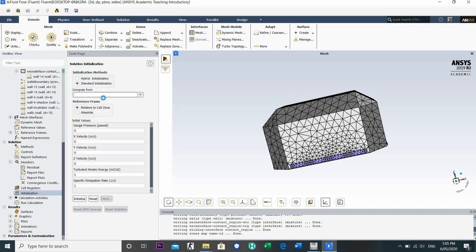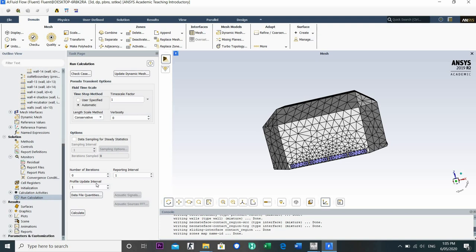Then we are going to use the standard initialization with all zones. All zones gauge pressure is 0, okay, initialize. This is gauge pressure 0 atm, because if it were absolute pressure, I think it would be 1 atm. Okay, it's already initialized so that we can run the calculation after it.